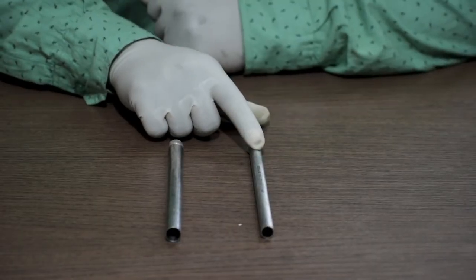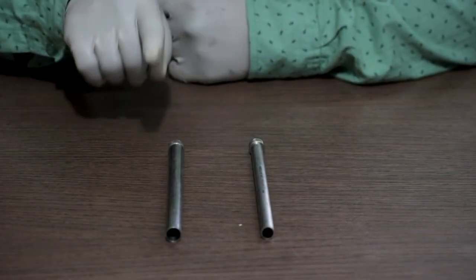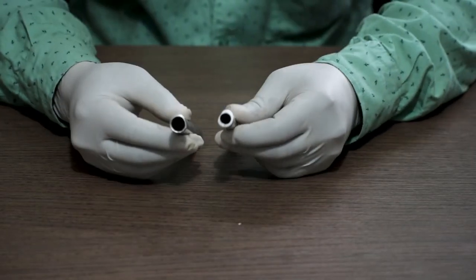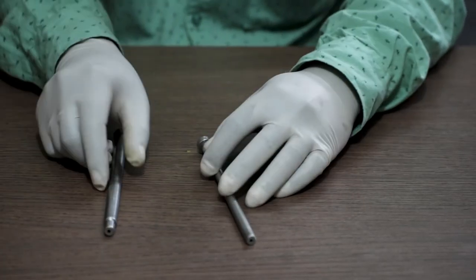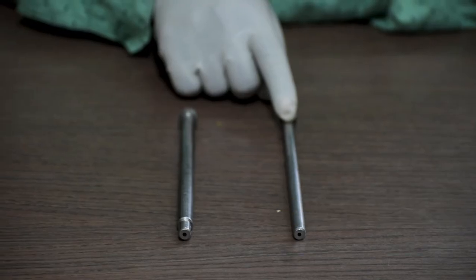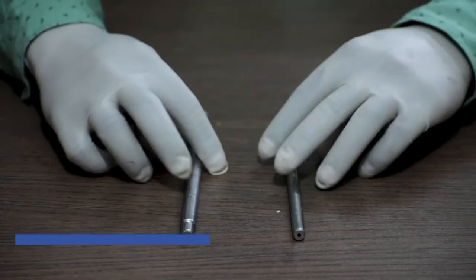Next, this is 6.4 mm proximal protection sleeve. And this one is 8 mm proximal protection sleeve. Next, this is 6.4 mm proximal guide wire sleeve. And this one is 8 mm proximal guide wire sleeve.